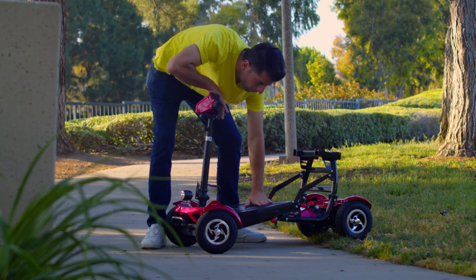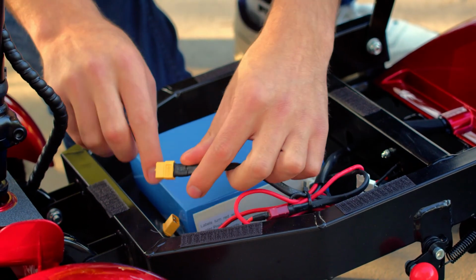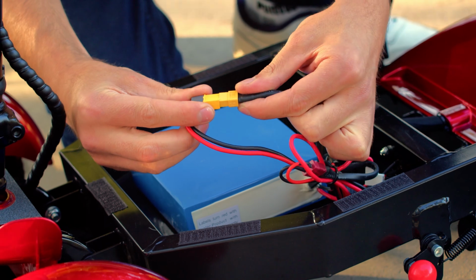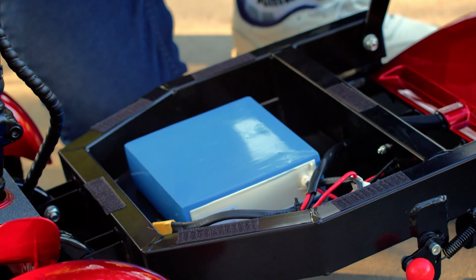This is how we unfold the scooter, but make sure you plug in the sockets of the battery connections before you use it. Otherwise, there won't be any power on the screen.